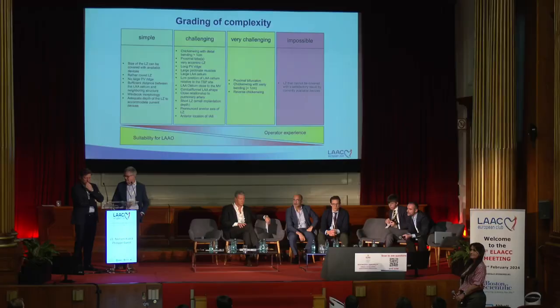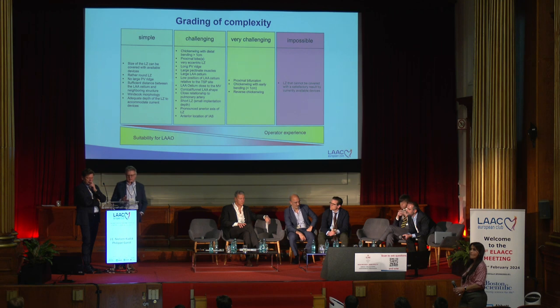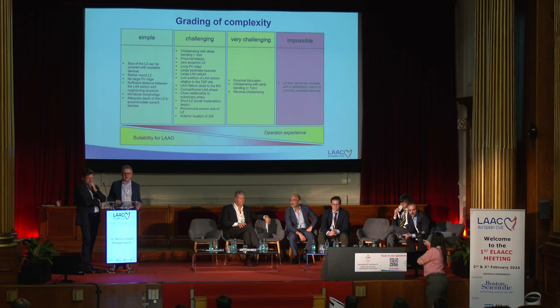Many of us have integrated all those things into our thinking about an LAA procedure, and it will also function as a kind of checklist before you go into a patient that you have considered all those factors. When we see all those publications about LAAC and this anatomical classification about chicken wing, they are not even divided into reverse chicken wing or long or short neck. It doesn't make any sense at all to talk about this classification.